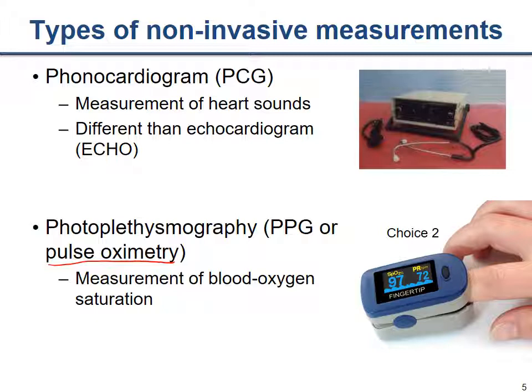It's a perfect example of how bioengineering and electrical engineering come together to provide a very useful solution. The measurements are performed by realizing that oxygenated blood is composed mostly of oxyhemoglobin, which we would call blood red, and does not absorb red light very well. On the other hand, deoxygenated blood is mostly composed of deoxyhemoglobin, which is dark red and does absorb light more.